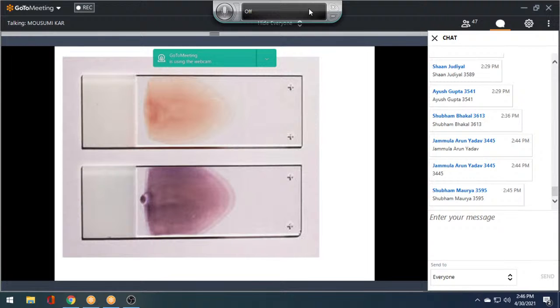The water will enter the RBCs, and you won't be able to understand whether the RBC is hypochromic or hyperchromic. The chromia you won't be able to understand. The RBC morphology will be unclear, because the water has entered the RBC and is forming a refractile droplet.